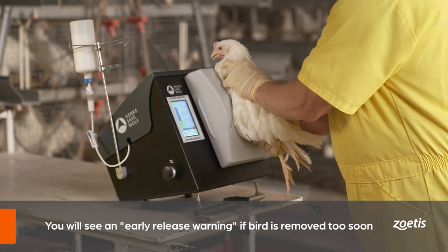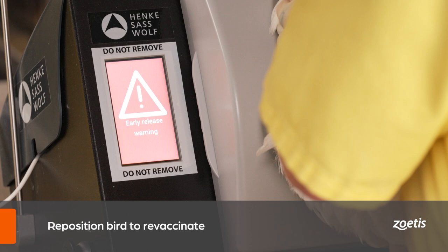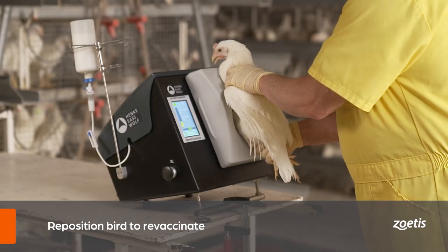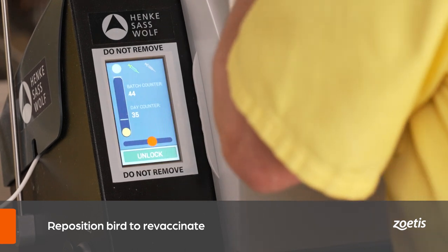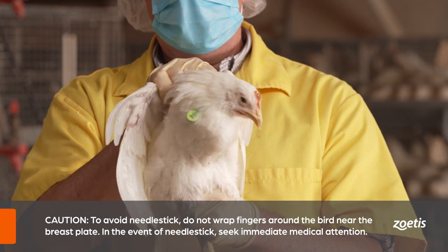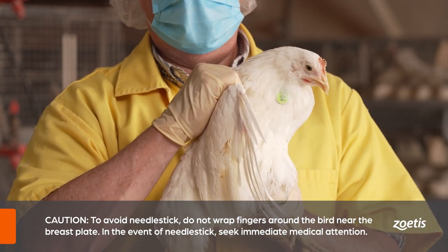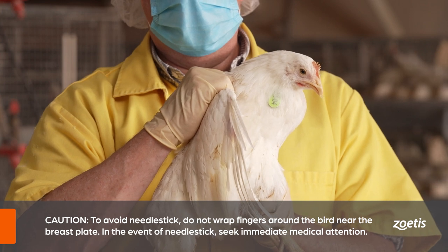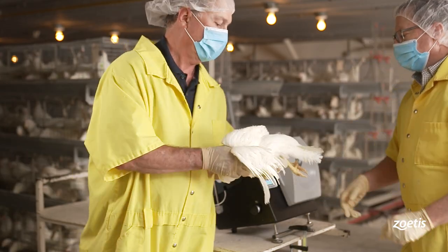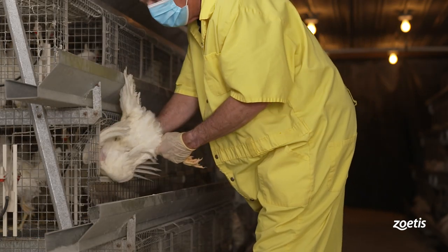If a bird is released too early, you will see an early release warning. When this happens, reposition the bird to revaccinate, since it is likely that the bird only received a partial dose. Caution: to avoid needle stick, do not wrap fingers around the bird near the breastplate. In the event of an accidental injection, please seek immediate medical attention.